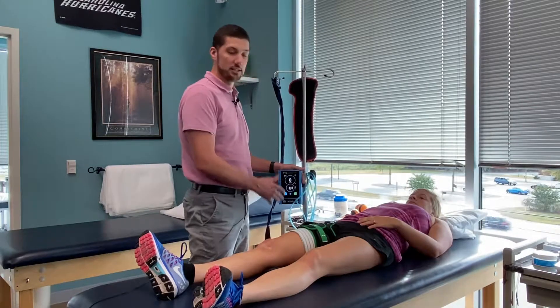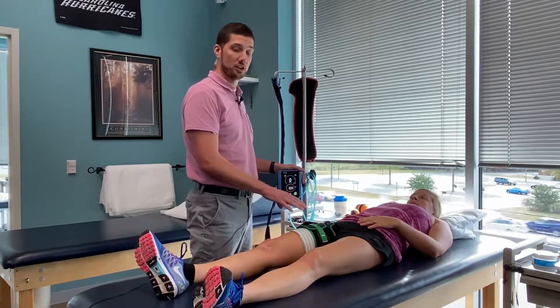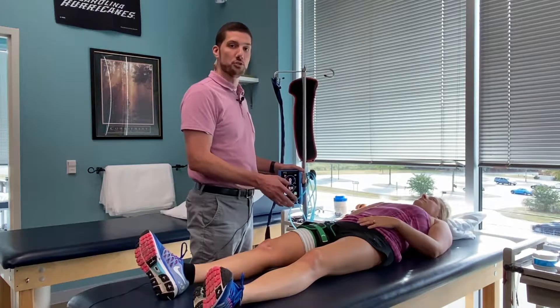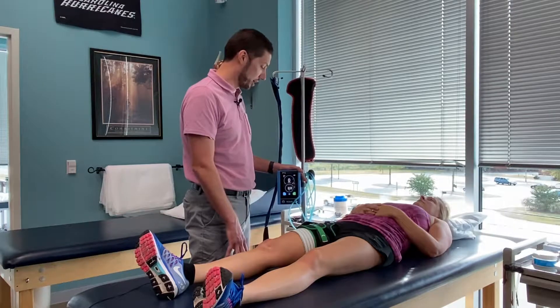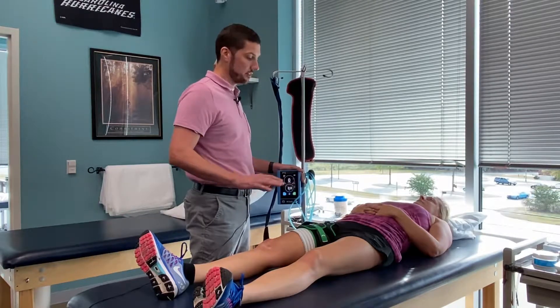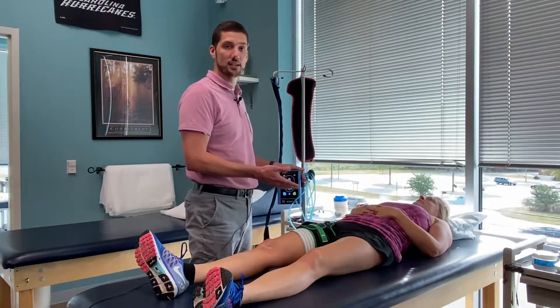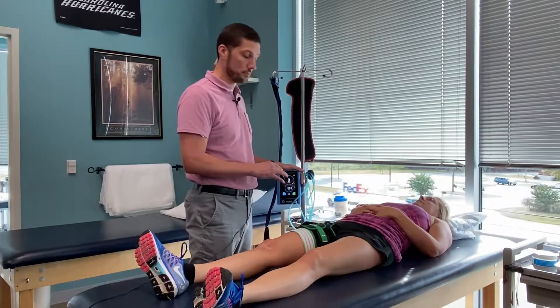In our clinic we use the Delfi tourniquet system. The benefit of this is that it has sensors within the actual cuffs themselves to allow for sensing the appropriate occlusion rate and sustaining that throughout the entire workout session. To begin, we'll have the individual lie on their back and calibrate the system, which will then tell us exactly what percentage we need to use during the exercise program.